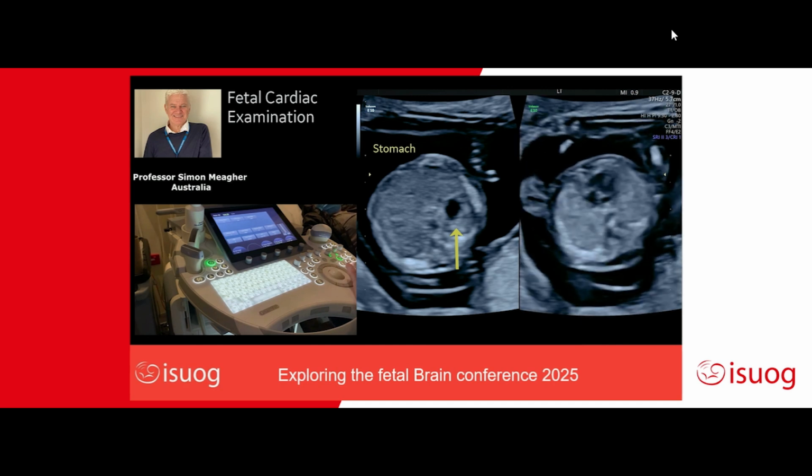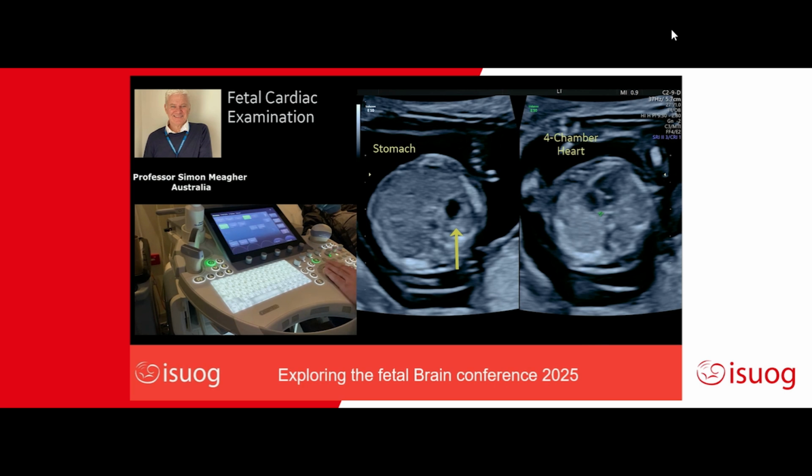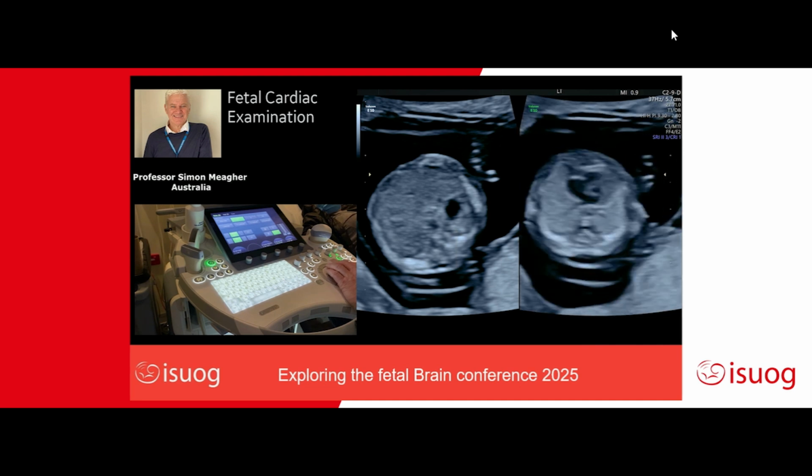and then I come up to showing the heart, and I briefly look at the heart. I eyeball this, but you can draw a line through the interventricular septum, and then draw a line through the spine and calculate your angles, but that's at about 45. So that's a normal cardiac axis.